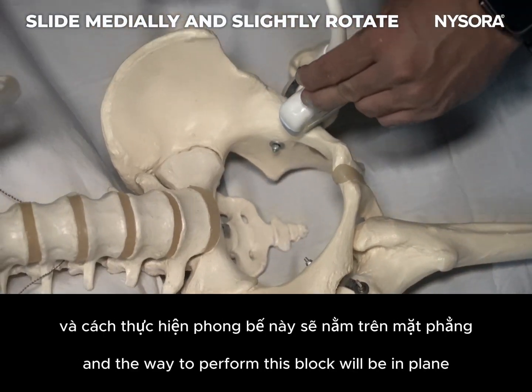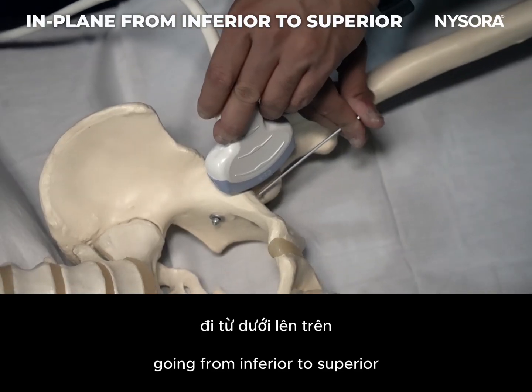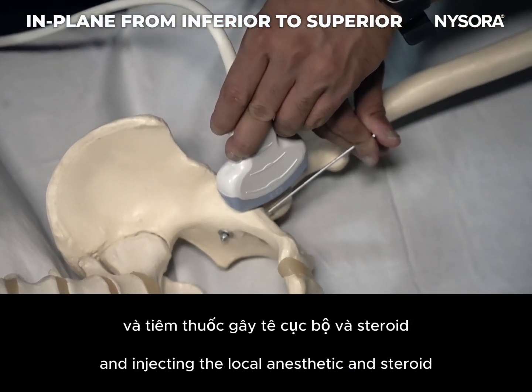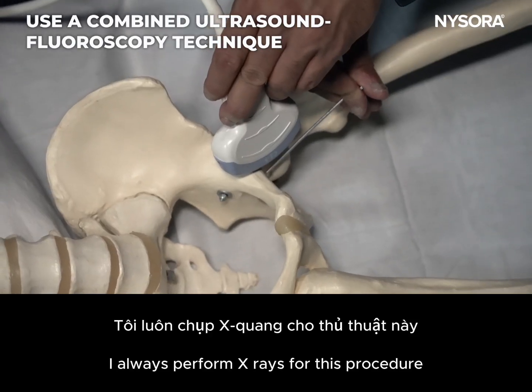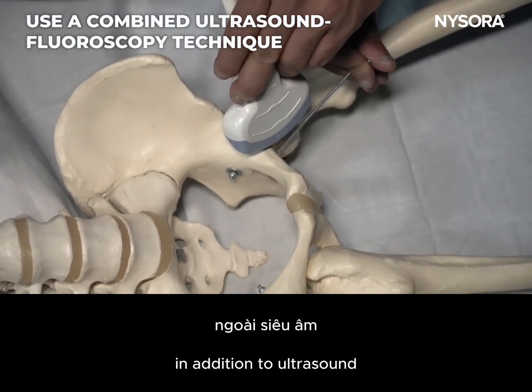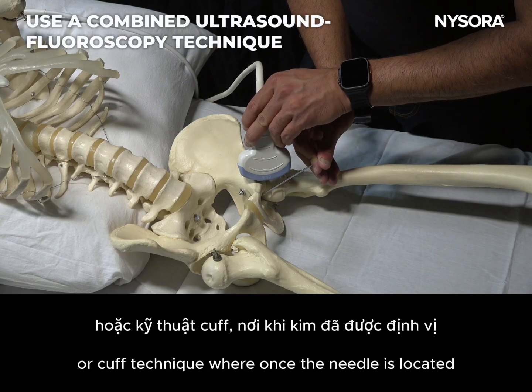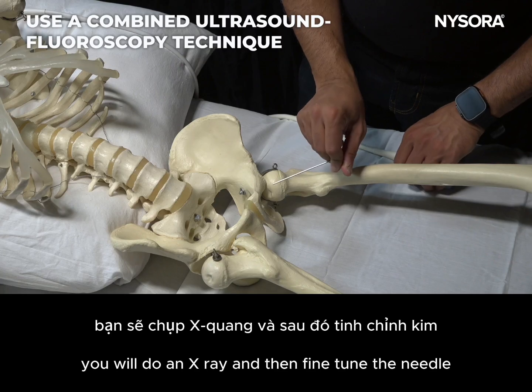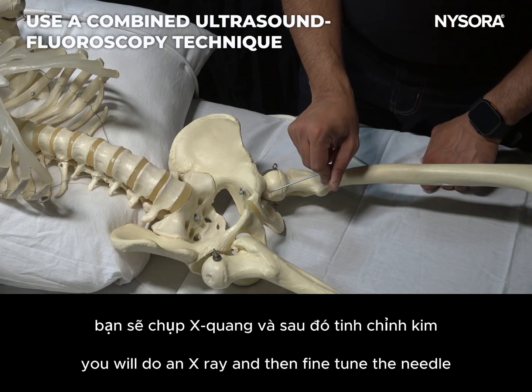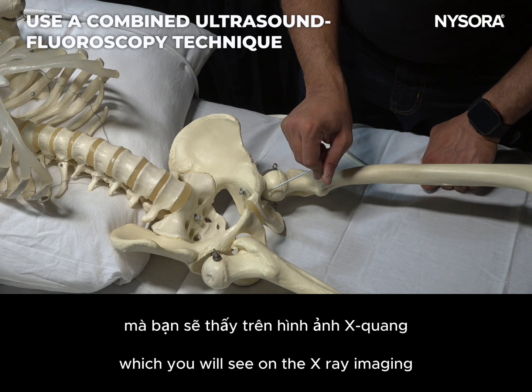The way to perform this block will be in plane, going from inferior to superior and injecting the local anesthetic and steroid. I always perform x-rays for this procedure in addition to ultrasound. I describe this as a combined ultrasound and fluoroscopy technique, or CUFF technique, where once the needle is located, you will do an x-ray and then fine-tune the needle and place it at what we call the lateral edge of the teardrop, which you will see on the x-ray imaging.